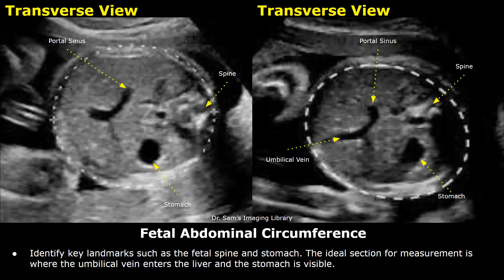This measurement is taken in the second trimester. A transverse view of the fetus is taken at the level of the stomach, the portal sinus, and the umbilical vein.